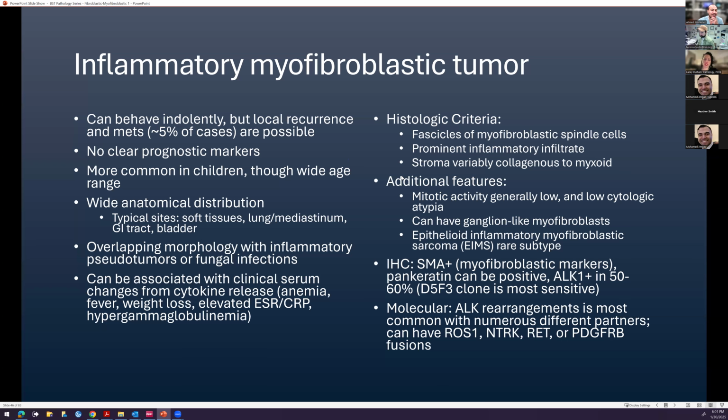I feel like the last one has these, what's it called? Curvilinear vessels. I saw those too. Right, it almost has a bit of a, oh, could that be myxofibrosarcoma? Maybe, right? Now that one was actually in the vocal cord, so it's probably not myxofibrosarcoma.